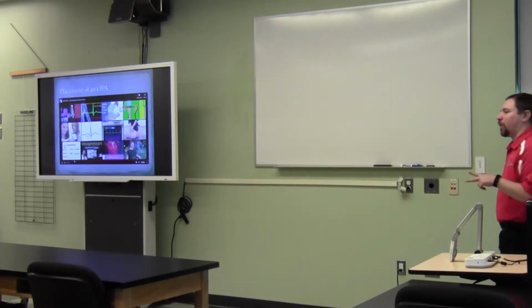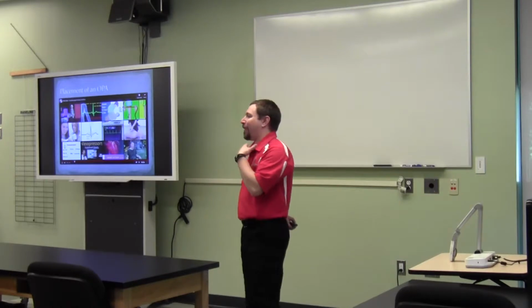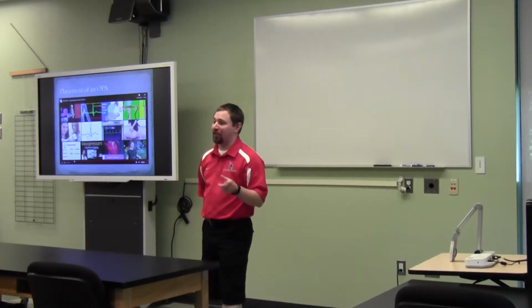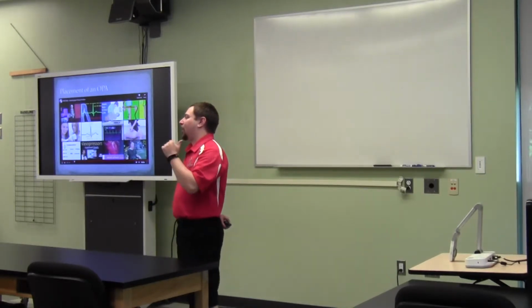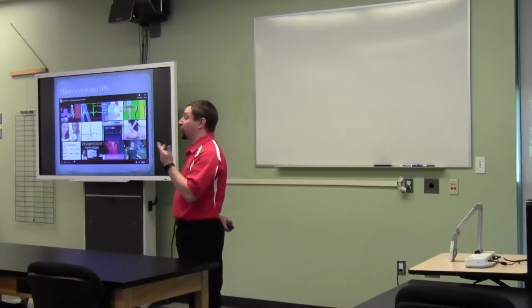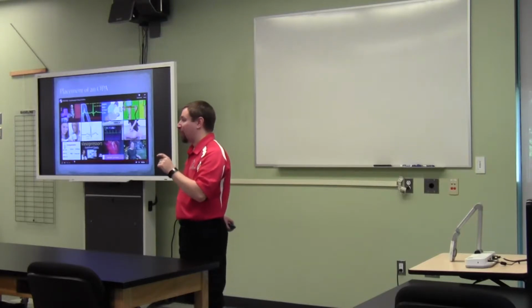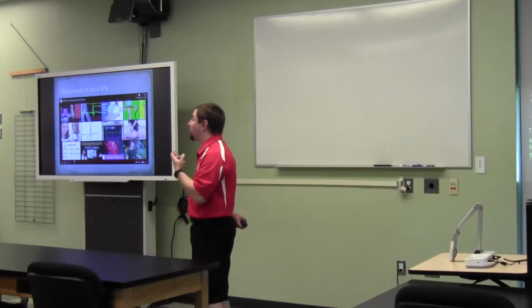So they showed two different ways. On our mannequins, the 180 approach cannot be done. The mouths do not open large enough for you to be able to pull that off. Okay, so don't even try it on the mannequins today. You'll just get frustrated. And they showed the anatomic placement. This is an ideal placement for younger children because their mouths are smaller and their tongues are proportionally larger in the mouth. That approach works the best for smaller children and smaller people.